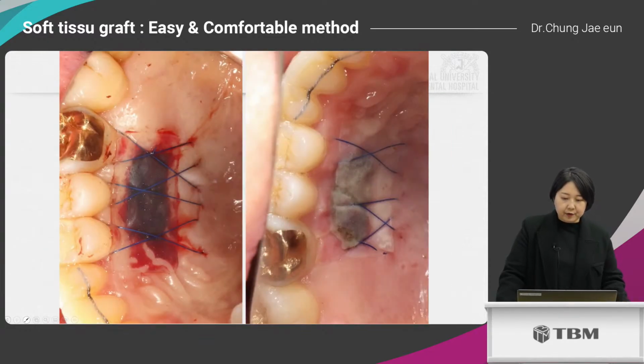And this is just after the surgery, the left side. I applied the Surgicel and Ora-Aid to cover the wound and the suture. The suture helped the dressing last for a few days. And this is 7 days after the surgery. The dressing remains at the wound site too.